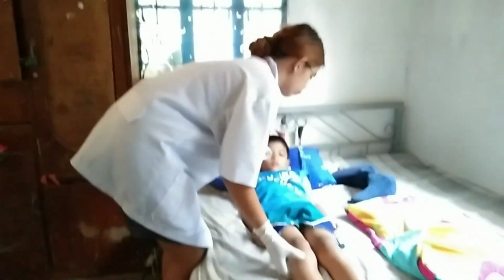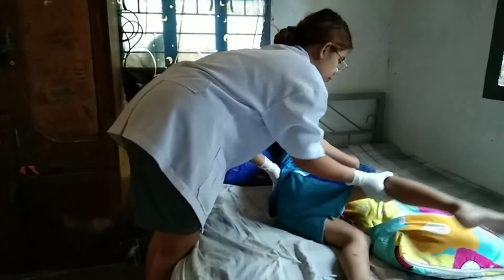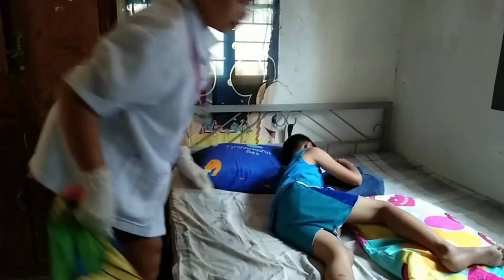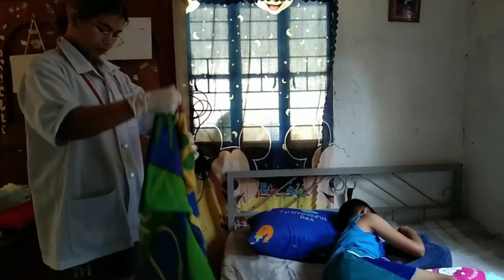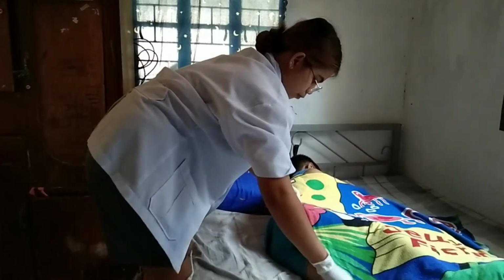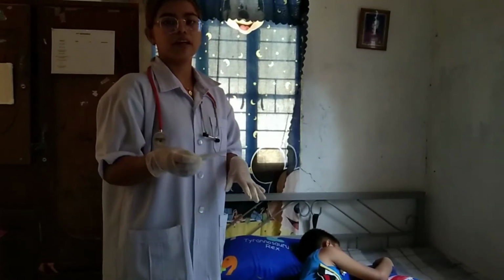So, sir, we're going to... So next, we're going to place the thermometer inside the rectal part of our patient.